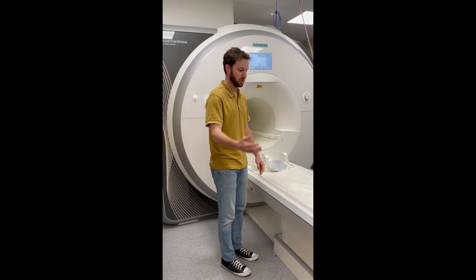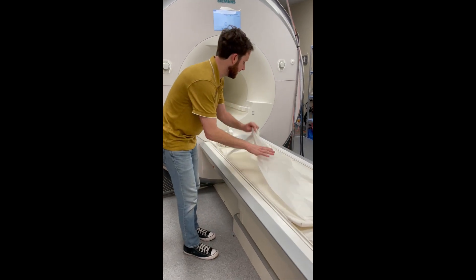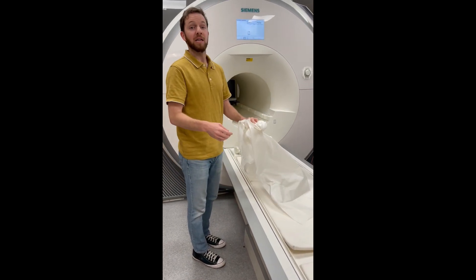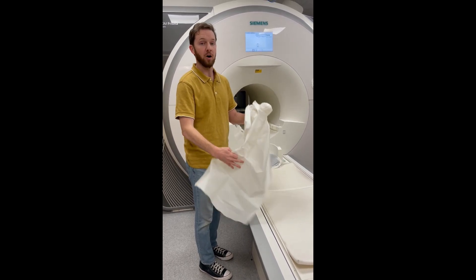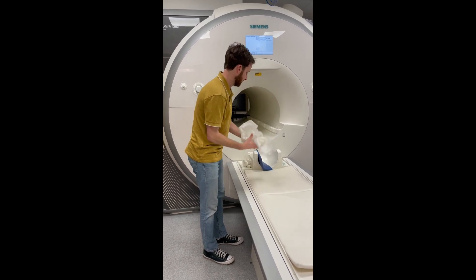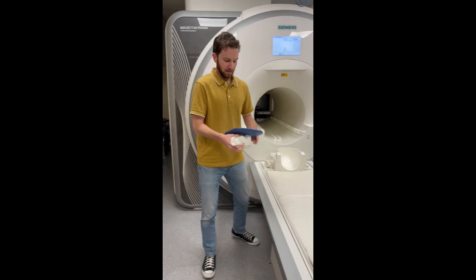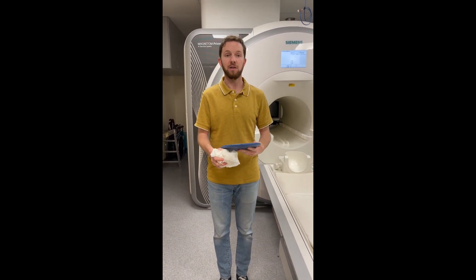Once your session is over and your participant has exited from the scanner room, please make sure you throw any used bed paper into the trash, which is located either in the control room or outside in the hallway. Since head cushions were covered by bed paper, they can go directly back into the cabinet.